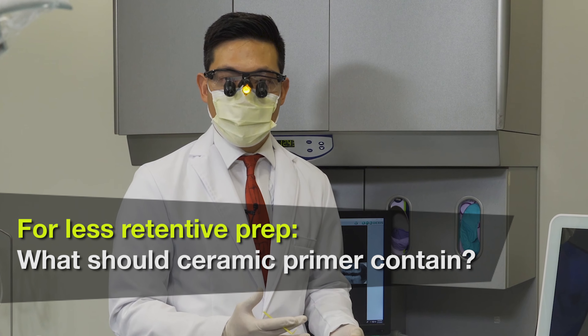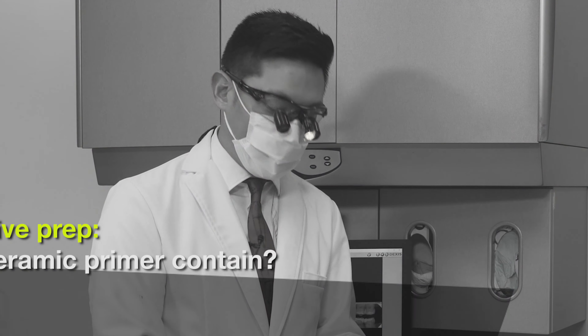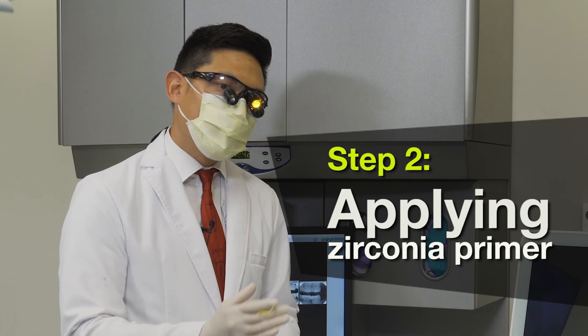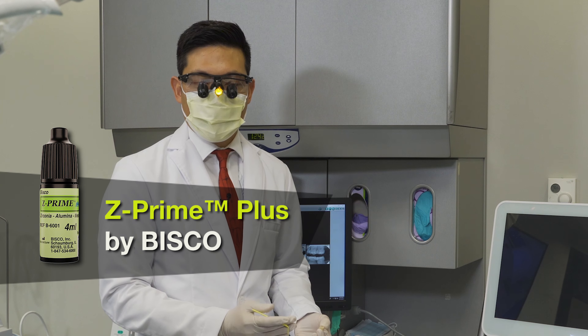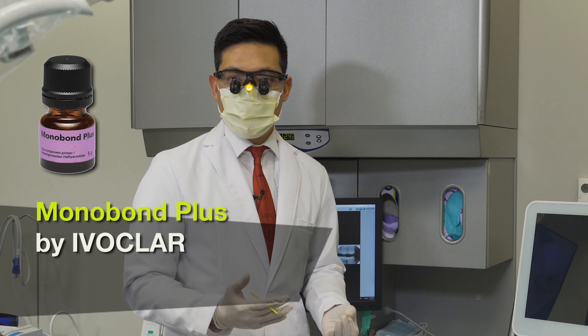Any ceramic primer that contains MDP is the key whenever you're bonding zirconia. So we have our decontaminated Bruxer crown, and now we're going to follow it up with a zirconia primer. There are several on the market — there is Z-Prime by Bisco, and there's Monobond Plus by Ivoclar.